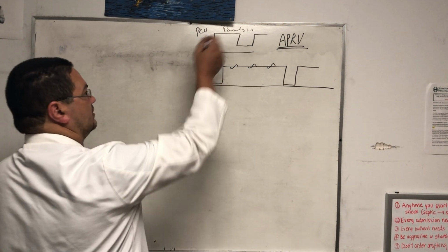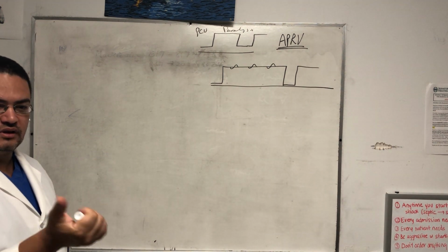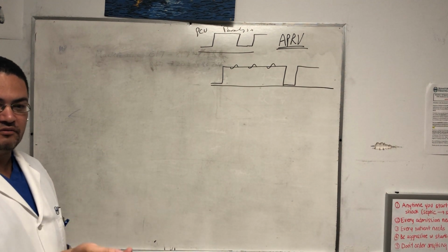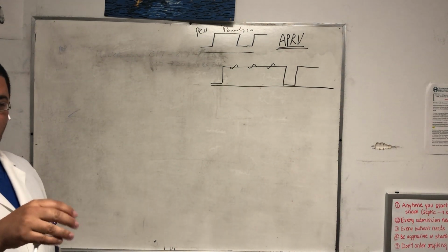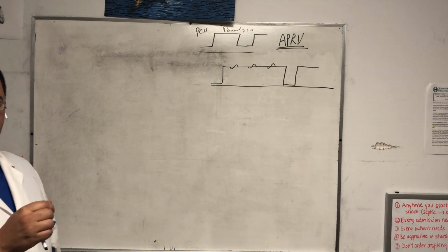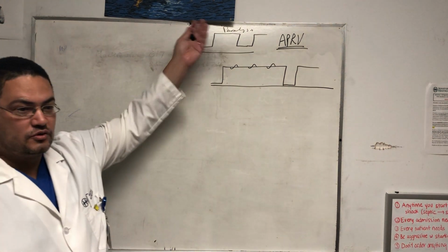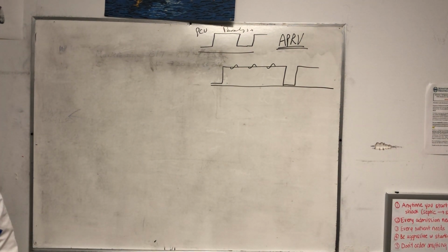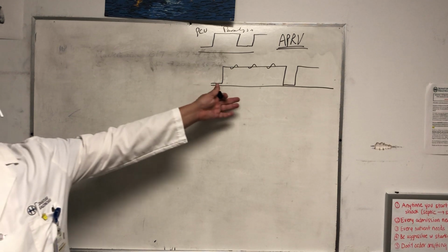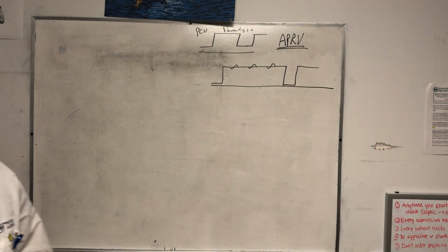Here, you can't breathe on your own. If you want to breathe on top of the pressure control like this, the machine doesn't assist you to breathe, nor even open a valve for you to breathe. So you are suffocated. And when the patient feels that, they get very anxious. And these patients are tachypneic, so they're not going to let you hold them up for 2 seconds. So you have to paralyze them for pressure control. And you shouldn't paralyze them for APRV, because you're benefiting from all of these small breaths.